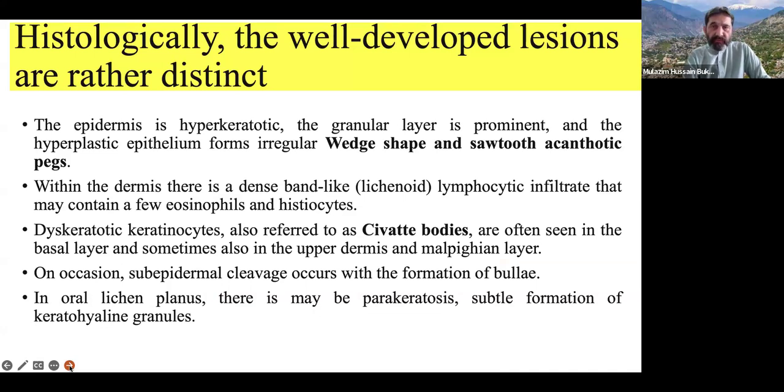And the wedge shape granulosus. Stratum granulosum becomes wedge shaped, while the dermoepidermal junction becomes sawtooth or jigsaw puzzle-like. Within the dermis, there are dense bands, as we have seen in the picture.